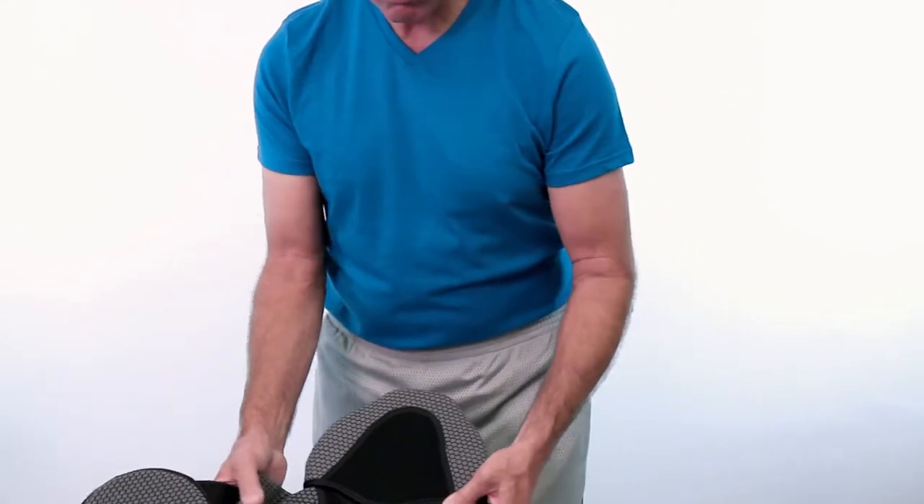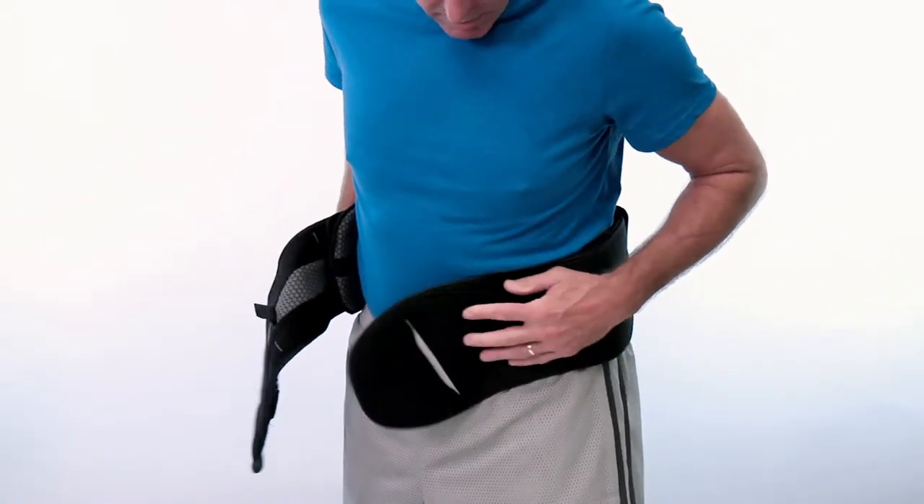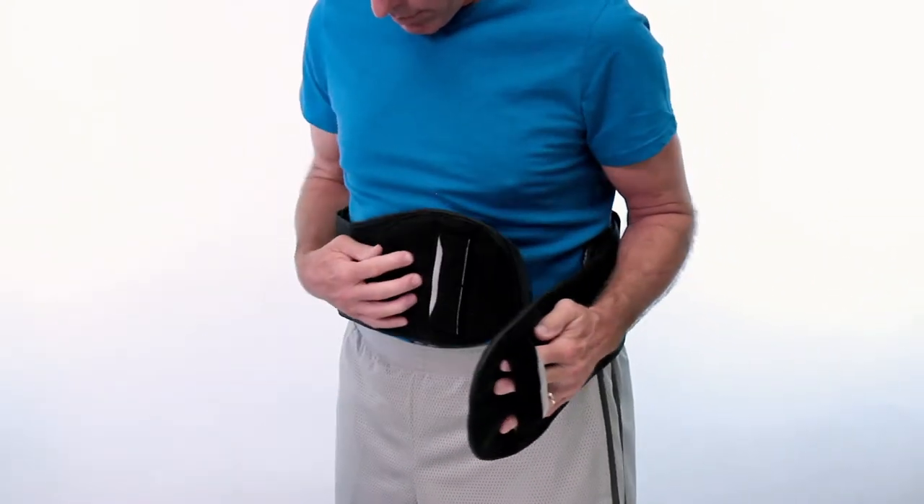To position the brace, center the back panel on the lower back. Slide your fingers through the loops on the belt wrap ends to assist with application.